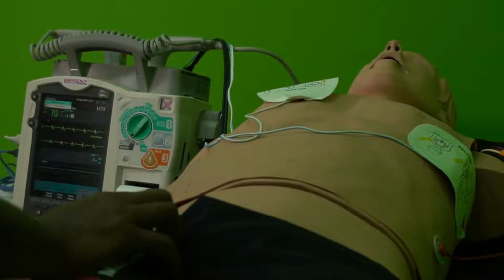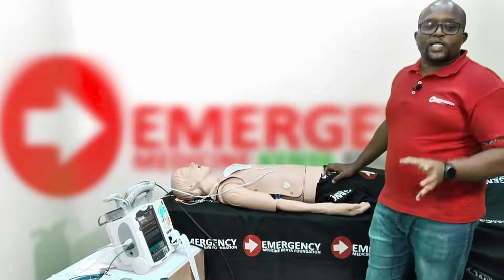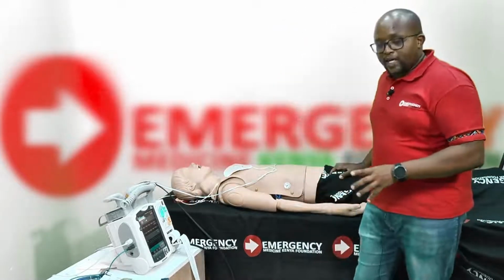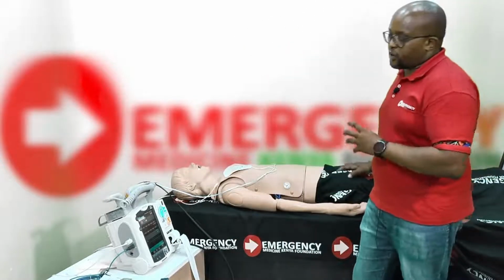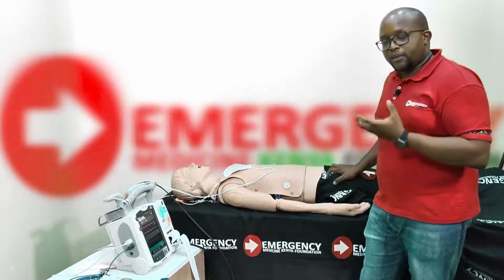My mechanical capture has been achieved, electrical capture has been achieved. So in a situation where you have electrical capture but no mechanical capture, consider increasing the amount of pacer output, essentially the amount of energy being transmitted to the patient, so that you can give that heart the kick required to get your mechanical capture.